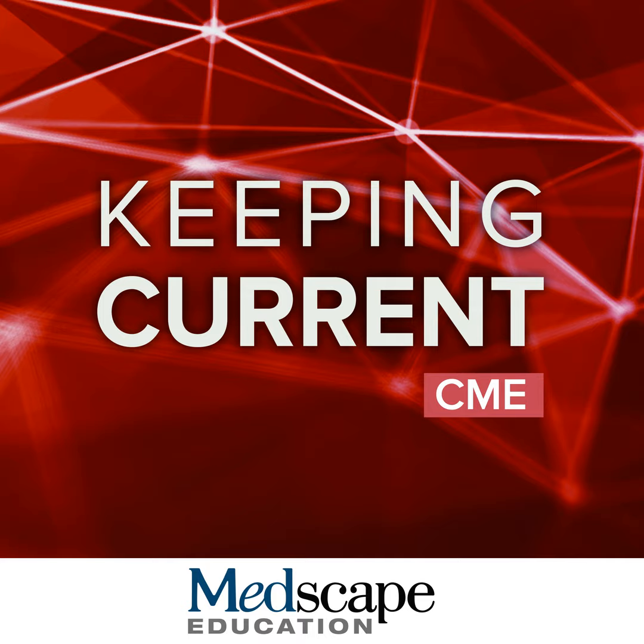But if we look, we have our hepatobiliary phase. We have an 11 millimeter nodule in the right hepatic lobe that is bright on diffusion. And you can see that it's not a cyst or hemangioma because it's almost occult on T2-weighted imaging. So we know that it's not something benign. So this would be a positive abbreviated MRI screening case.